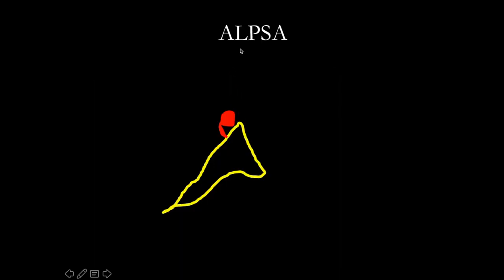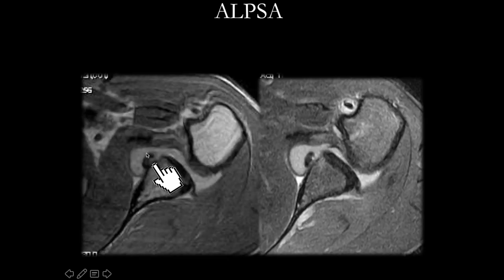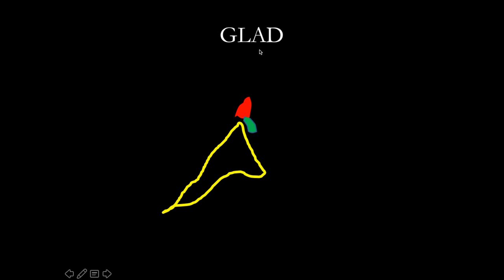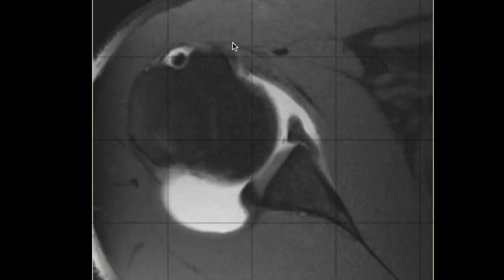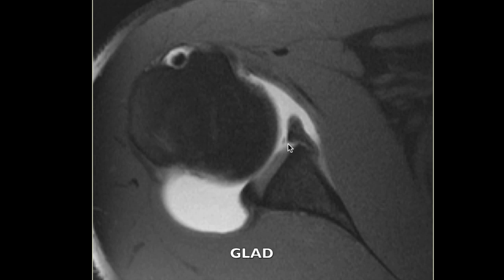ALPSA — anterior labral periosteal sleeve avulsion — is a condition in which the labrum is torn, the periosteum is still intact, and the labrum gets bunched up, displaced inferiorly and medially like a rolled-up shirt sleeve. Here is an example: the torn anterior inferior labrum has been displaced medially and inferiorly. GLAD — glenoid labral articular disruption — is a condition where you see a tear of the labrum and a piece of the adjoining glenoid cartilage has also come off along with it.